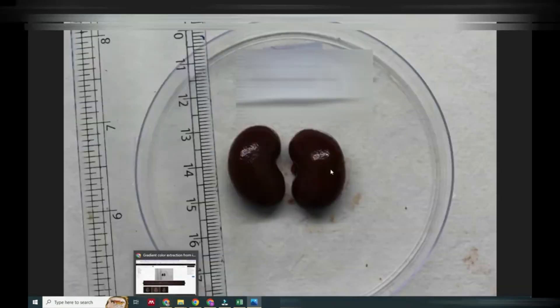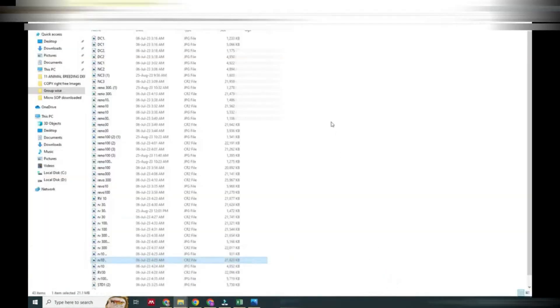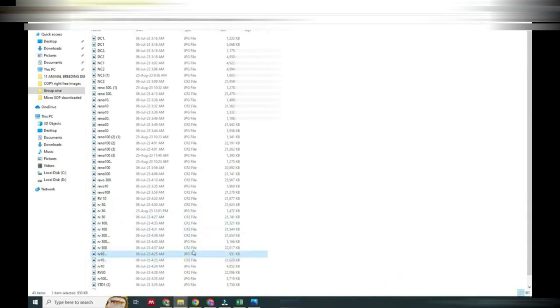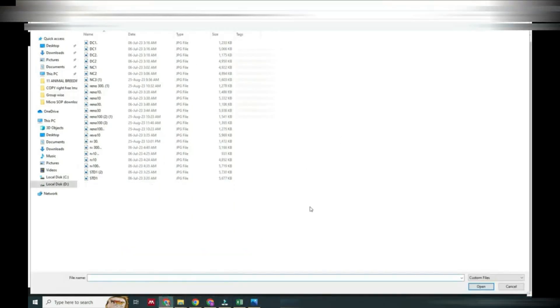Now our image is ready, converted from CR2 to JPG. This image we will select and open in color.adobe.com. We will go through that and open it.